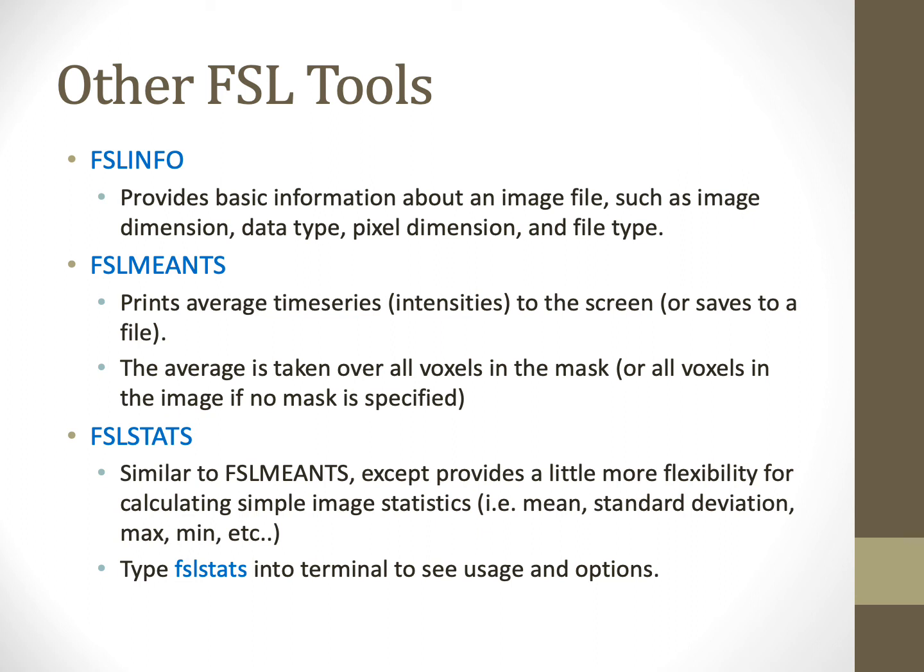fslstats, which is similar to fslmeants, provides similar functionality but offers more flexibility for calculating simple image statistics. For example, calculating the mean, standard deviation, the maximum across images, the minimum across images, etc. Type fslstats into the terminal to see usage and different options.